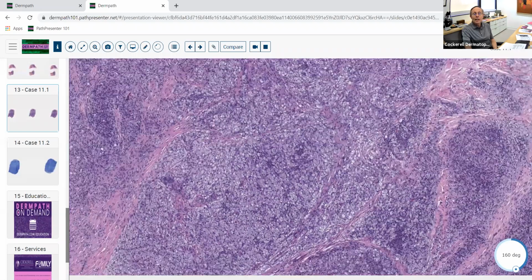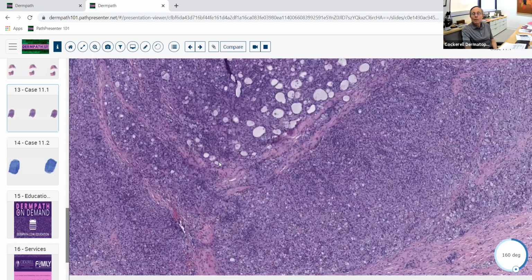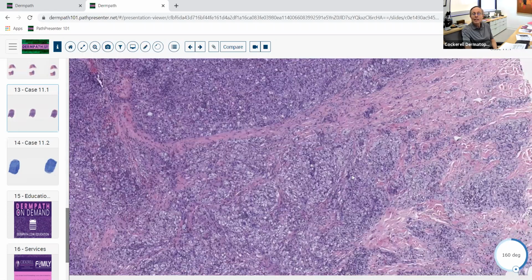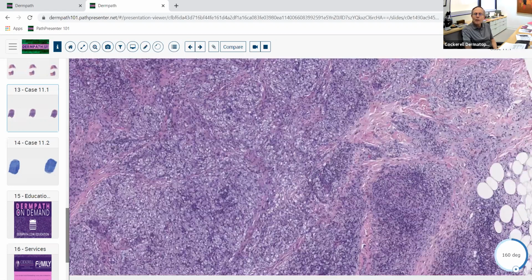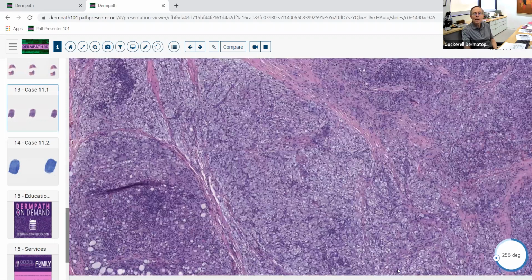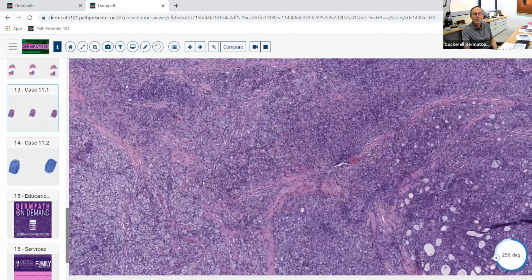And this is a very multibacillary form of the disease here. It goes all the way down into the subcutaneous fat over here, as you can see. Maybe this should have been oriented at 90 degrees. Maybe we'll go that direction for you, but it doesn't make any difference because no matter where you look, top to bottom, side to side, it's just loaded with granulomatous inflammation that contains all of these cells in it.